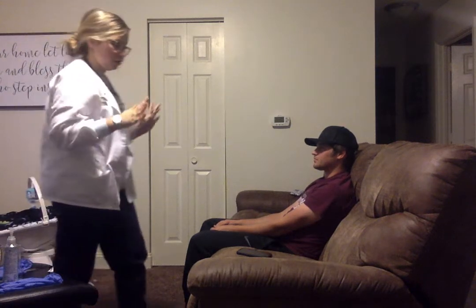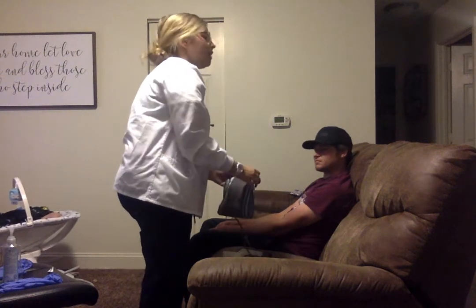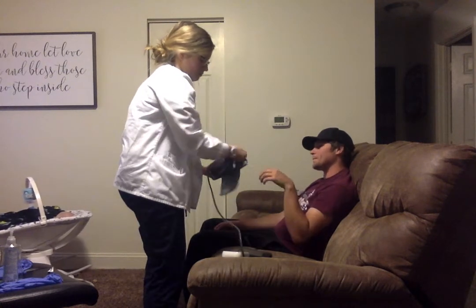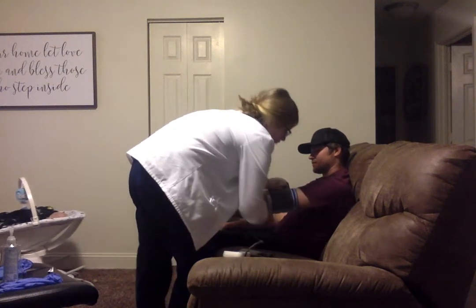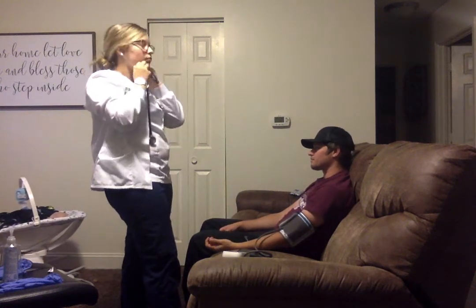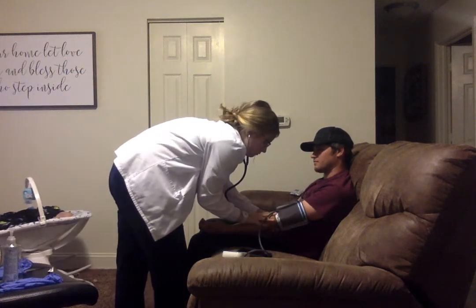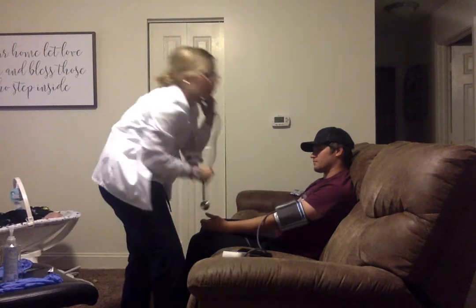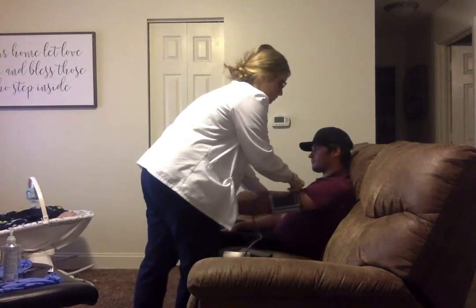I've washed my hands before I've touched my patient. Now on a scale of 0 to 10, with 10 being the most excruciating pain you've ever felt in your life, can you tell me if you're in any pain today? 0. Okay. I'm going to start out with blood pressure. Patient's blood pressure is 128/82.